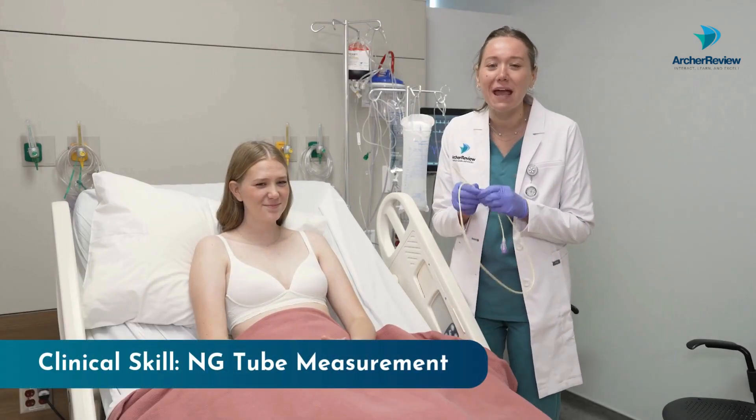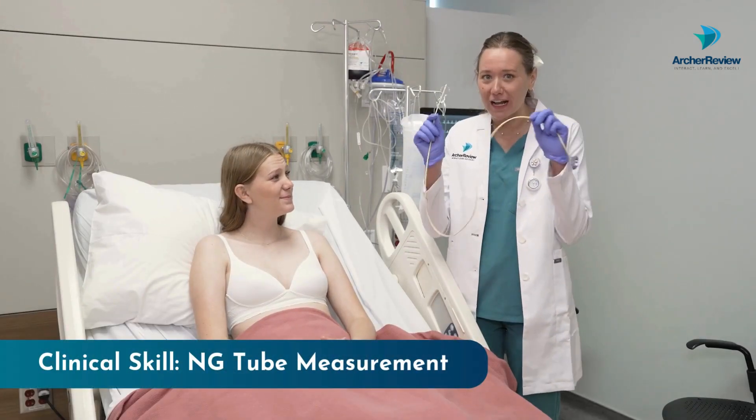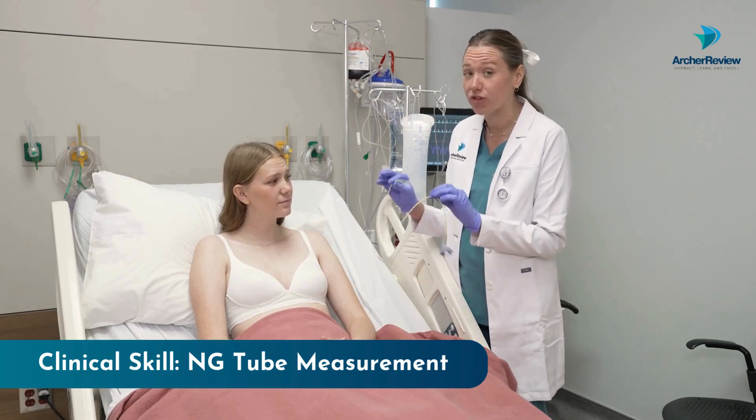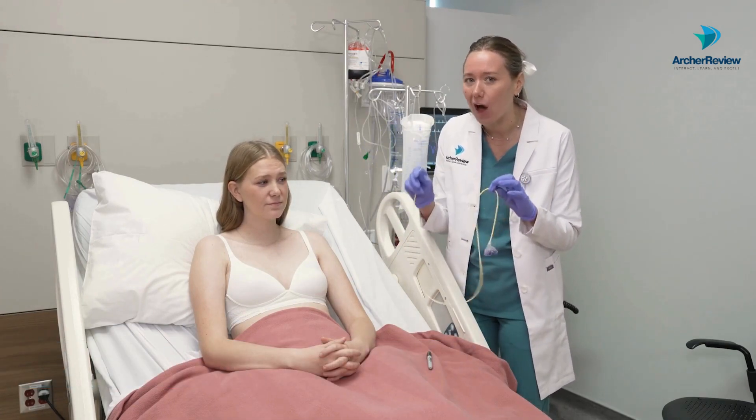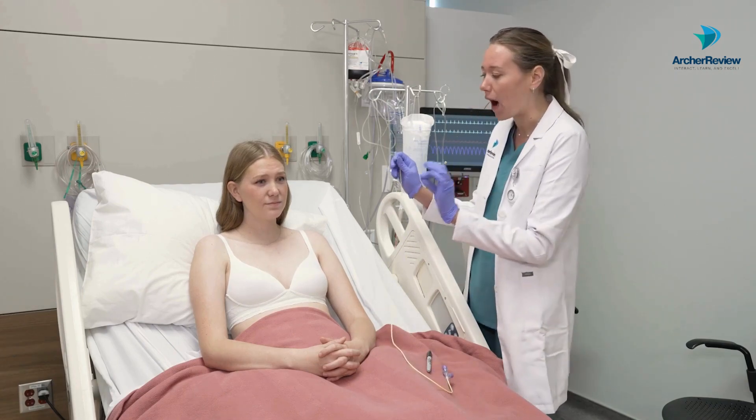Hi guys, Dr. Kaffir with Archer Review. Today I'm going to be showing you how we measure an NG tube. We want to make sure that we measure this properly so that the NG tube ends up in the stomach where we want it and not anywhere else. It's a pretty simple procedure and I'll show you how.